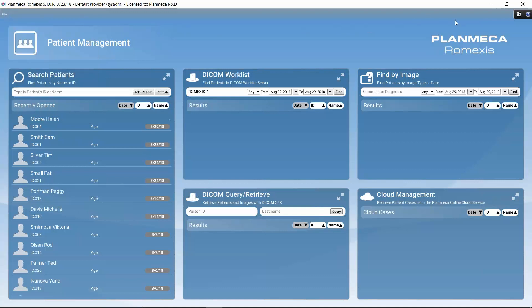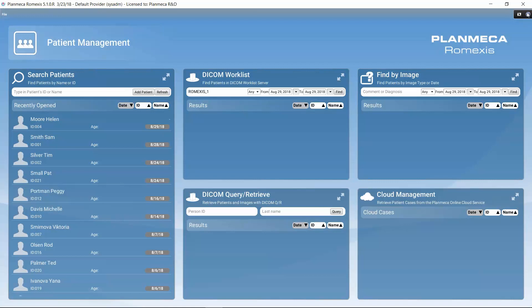In the other corner we have help buttons. With an internet connection, clicking the film icon opens the tutorial video page on the PlanMega website, where you can find videos about the different modules of Romexis. If we have a PDF reader, clicking the question mark icon opens the Romexis user's manual, where we can use the search function to find information about different features.